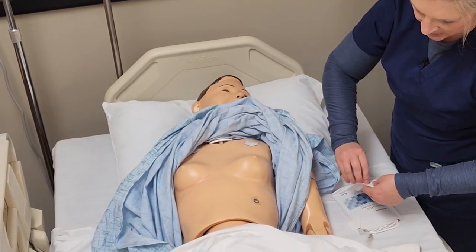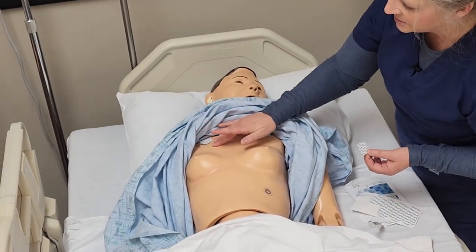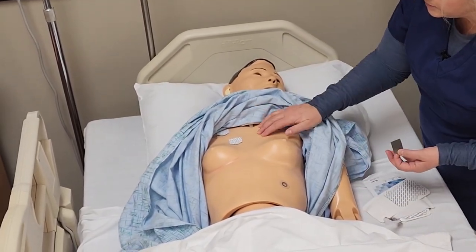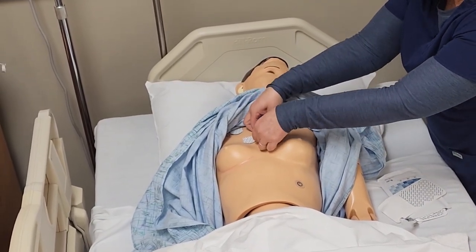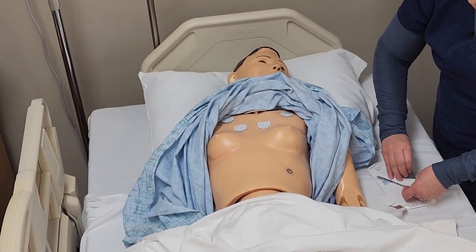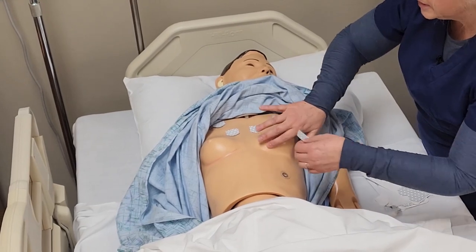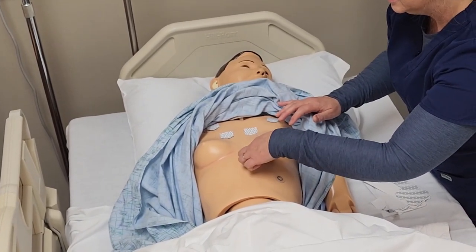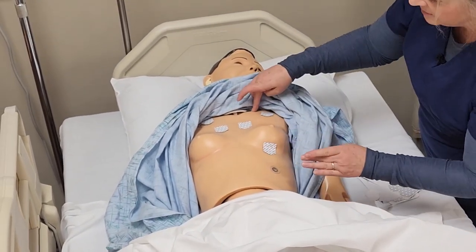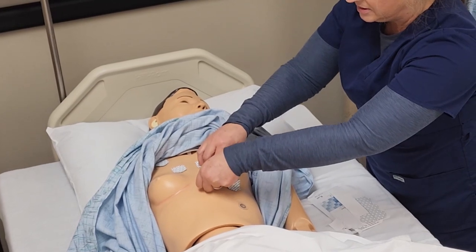We're going to find the fourth intercostal space, both on the right and left of the sternum. Count down four and place V1 there. Our V2 will be in the fourth intercostal space to the left of the sternal border. We're going to place V4 in the fifth intercostal space at the mid-clavicular line, and then V3 goes in between V2 and V4.